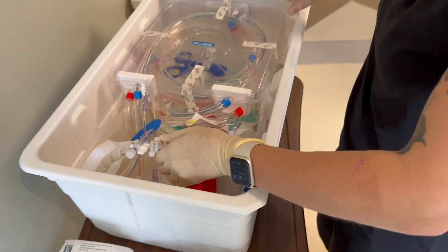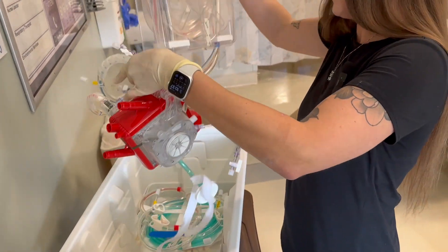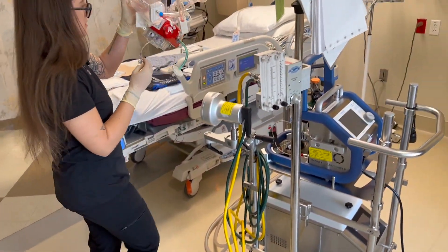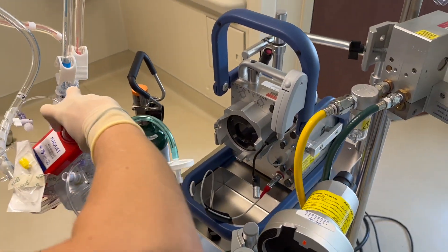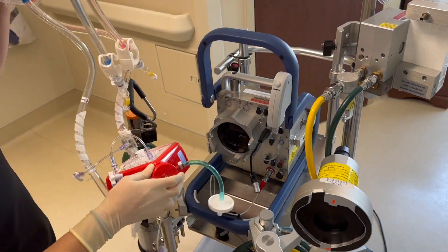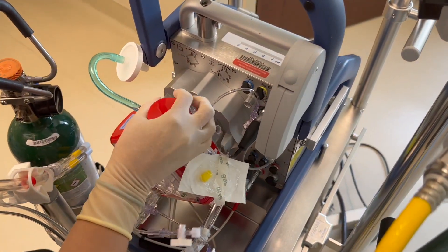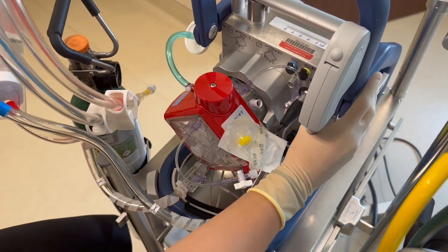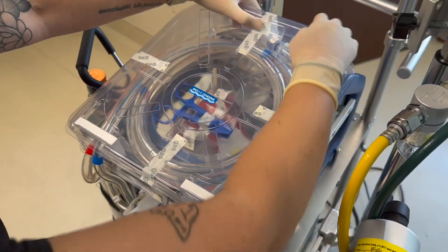Now you will take the oxygenator out from the box and place it on your cardio help. It can only go in one way. You place it in and then you turn it to the left, and you'll hear the click. Then you'll close your safety guard and place your circuit on top.